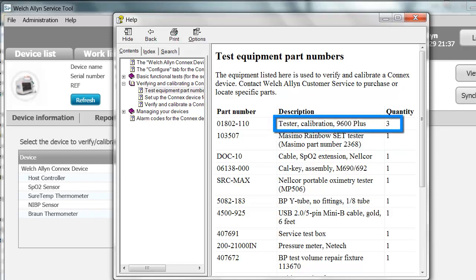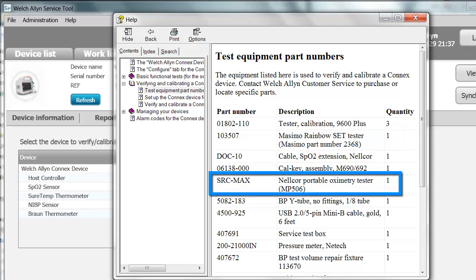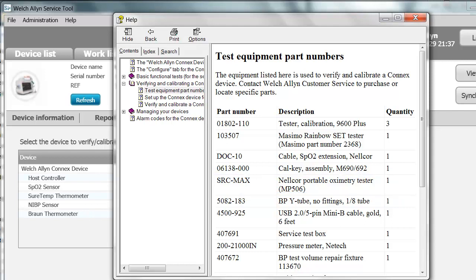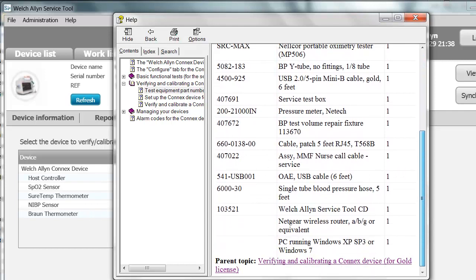Welch Allen recommends three 9600-plus testers. If you have Massimo, you will need the Massimo Rainbow Tester. If you have Nelcor, you need the SRC Max and the various cables and test equipment. The only required tools you must purchase from Welch Allen are the Service Test Box, Nurse Call Cable, and the Cal Key. The SRC Max you can purchase from Nelcor, the Massimo Rainbow Set Tester from Massimo, and the rest of the equipment can be equivalent alternatives.